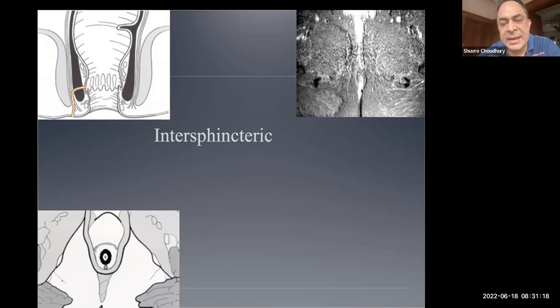And I see time and time again, even in my own centers, that people will do 12 sequences and the surgeons will get upset, the patient will get claustrophobic. So we just need to understand what we are trying to address. We are not trying to address the whole world here. We are only trying to address the anal sphincter anatomy.